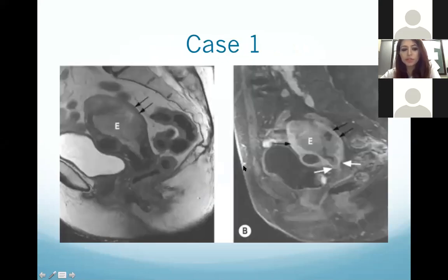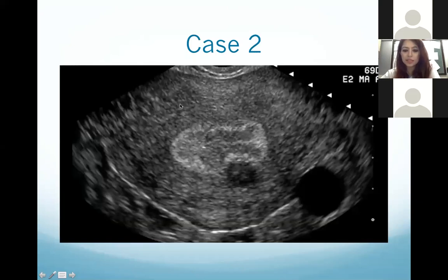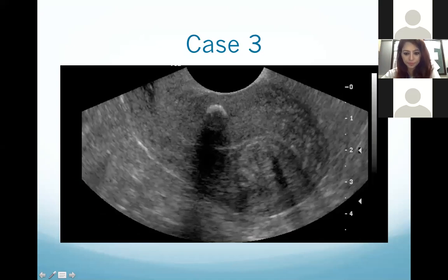Here are some revision images. This is a uterus with a small intramural fibroid in the anterior wall and a large mass in the endometrium infiltrating into the myometrium — this is endometrial carcinoma with a small intramural fibroid. Another ultrasound shows an endometrium, myometrium, and a small black area in the posterior wall — an intramural fibroid indenting the endometrium. Another case shows a calcified fibroid in the anterior wall with a markedly thickened endometrium and a submucosal fibroid within the endometrial canal.